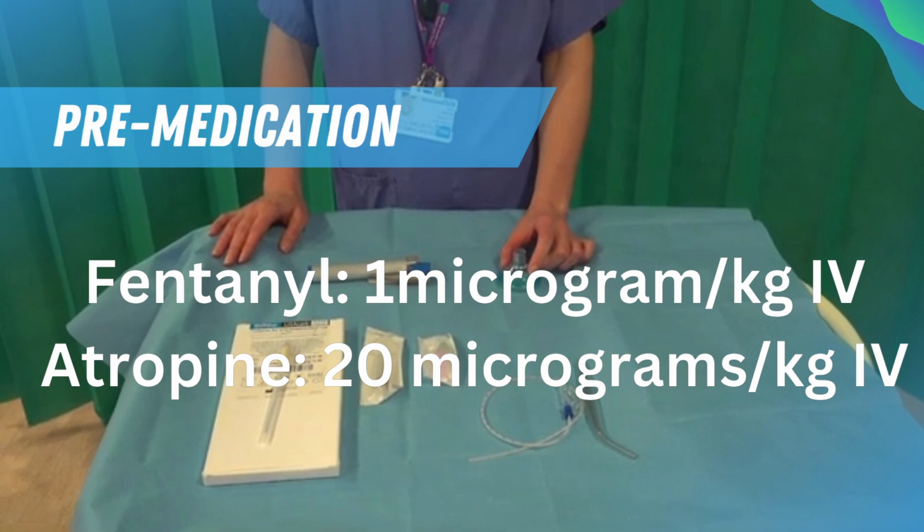Passing a catheter through the vocal cords can also provoke a strong vagal response, causing bradycardia. Fentanyl can be used as an analgesia, but please remember to give and flush this very slowly. Atropine should be given if you think the baby is prone to bradycardia. More detailed information on pre-medication can be found in my video on neonatal intubation, linked at the top of the screen. The baby should remain on CPAP throughout the procedure.